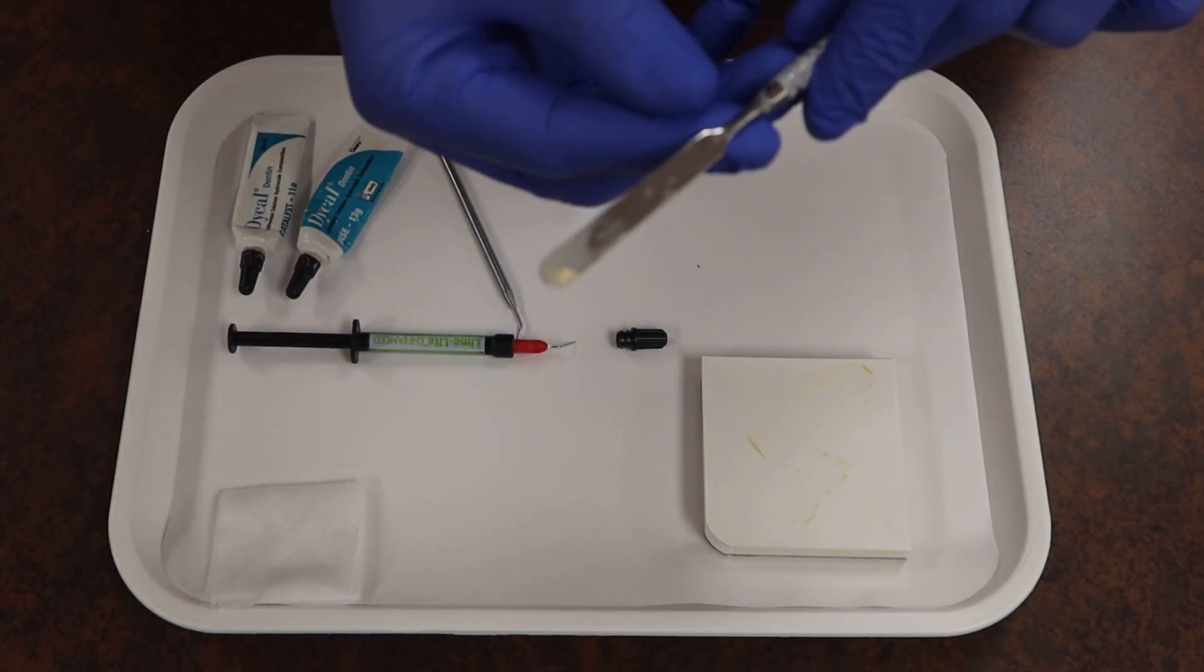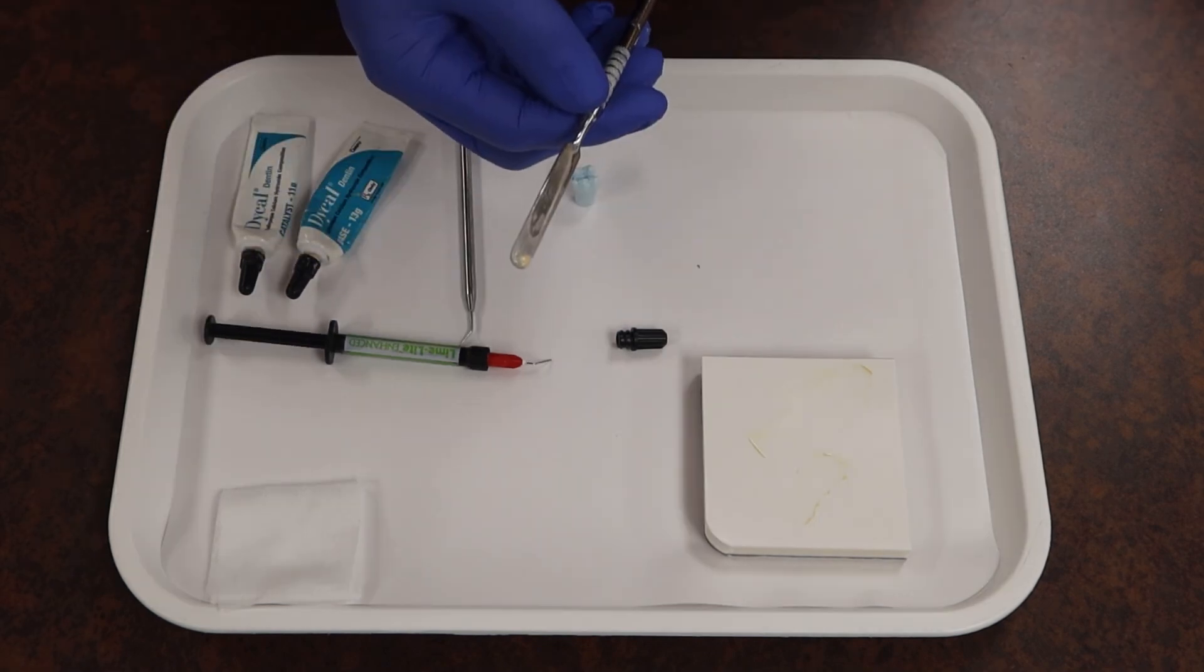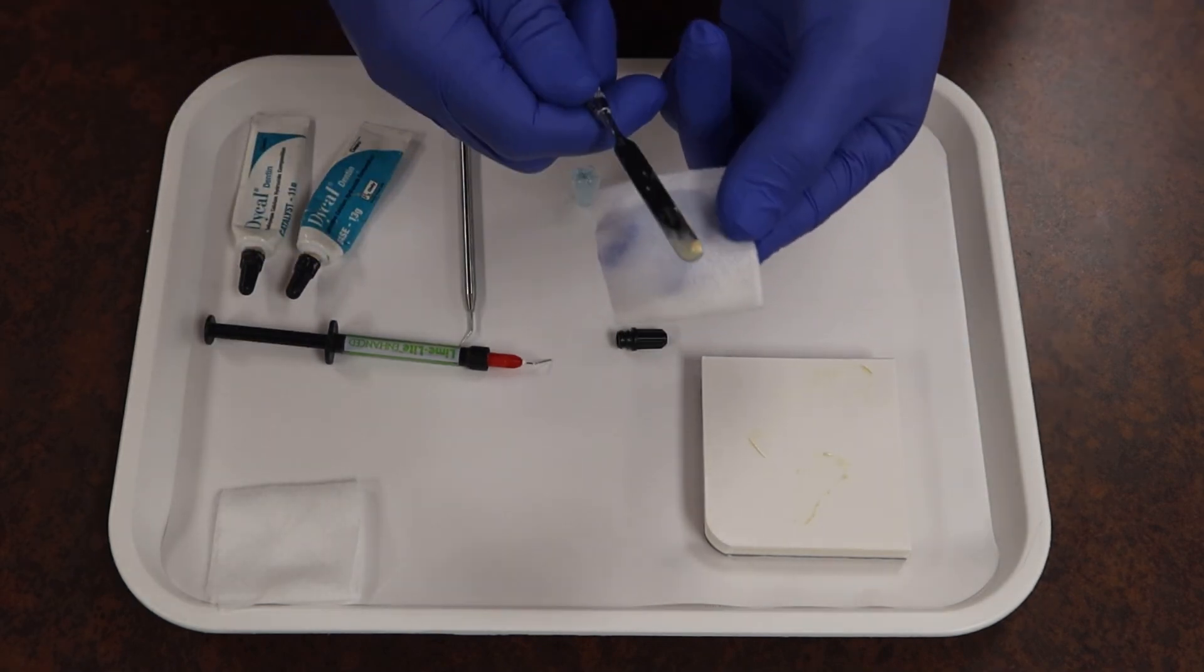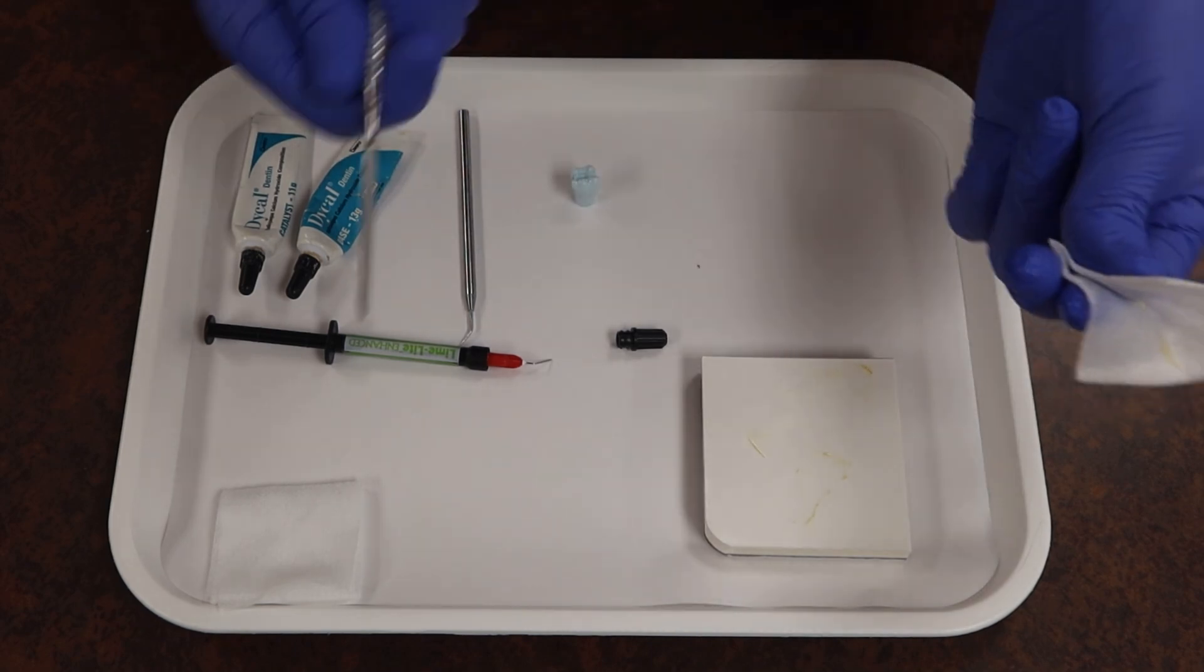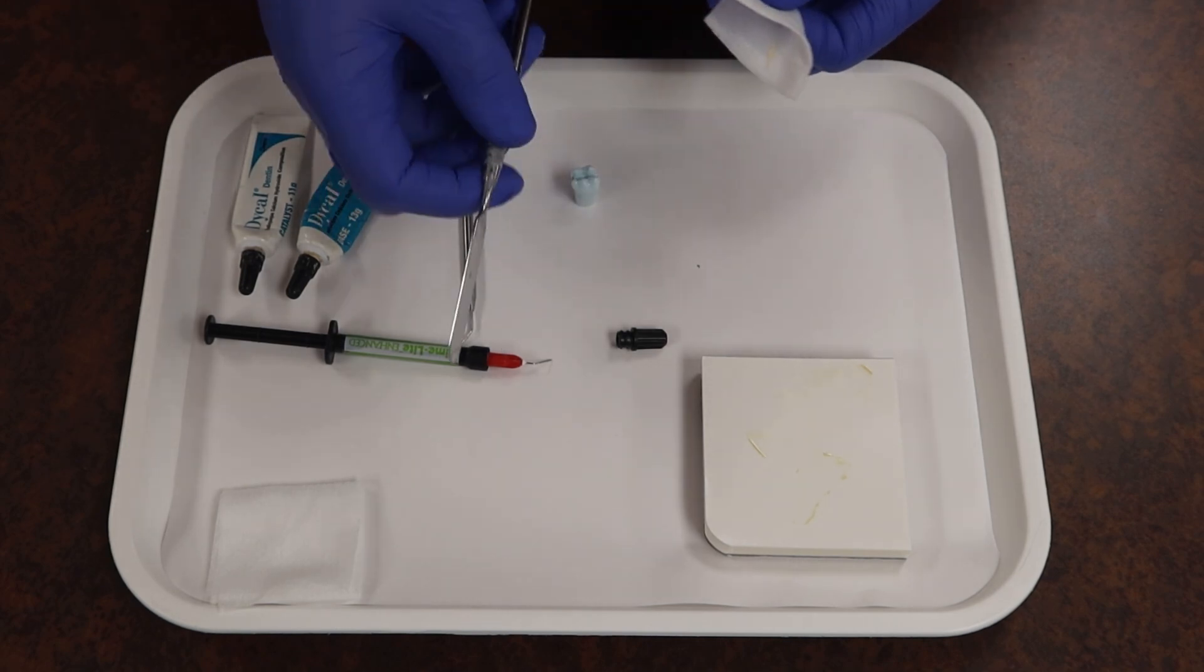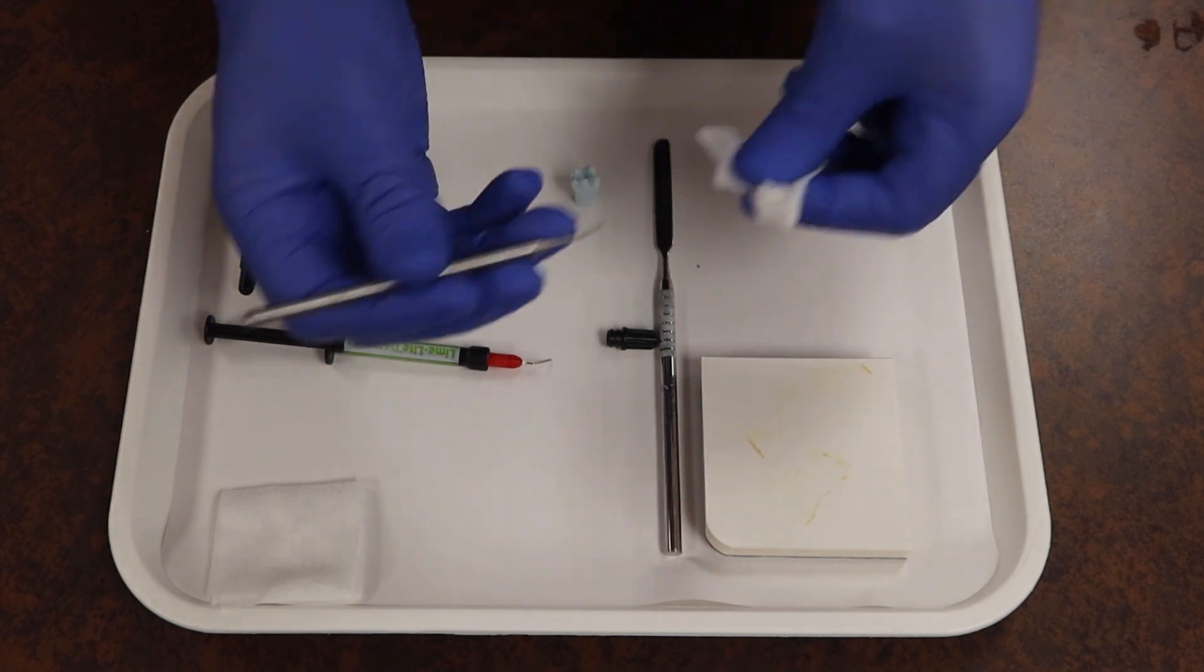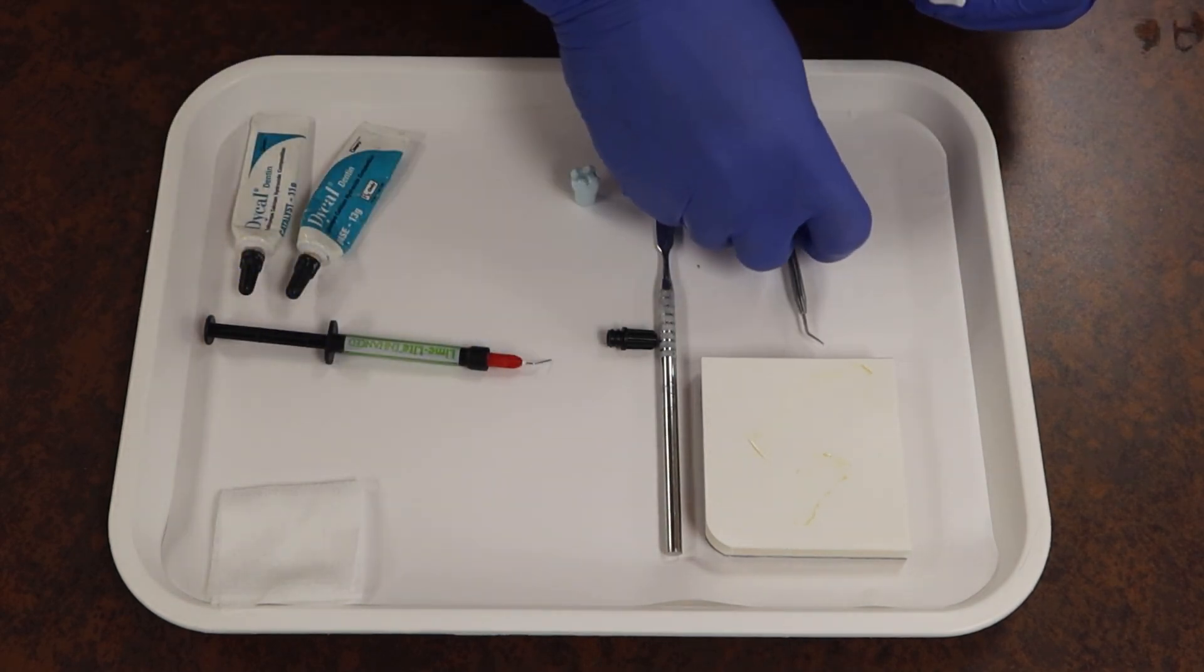Of course, whenever we're working with dental materials, we don't want to leave any material on our spatula once we are done with it. Make sure you always have a nice alcohol two by two or something nearby so you can go and wipe the material off and be done with it. Just as I have here, nice and clean for the sterilization to not have to work any harder than they already do. And same thing with your application instrument, go ahead and give that a nice smear and wipe.